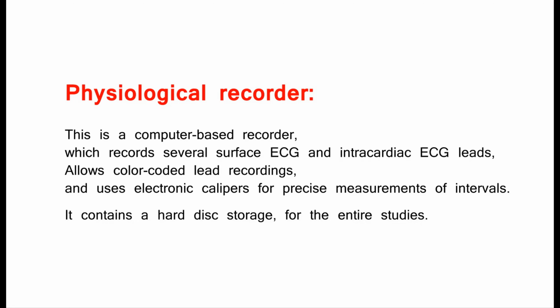Physiological recorder. This is a computer-based recorder, which records several surface ECG and intracardiac ECG leads, allows color-coded lead recordings, and uses electronic calipers for precise measurements of intervals. It contains a hard disk storage, for the entire studies.